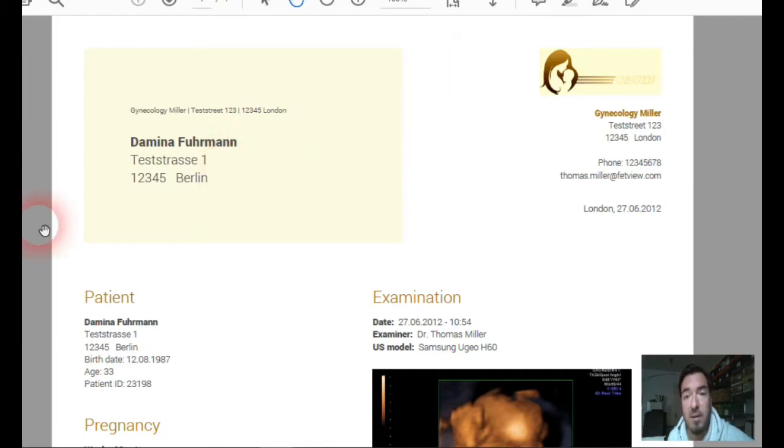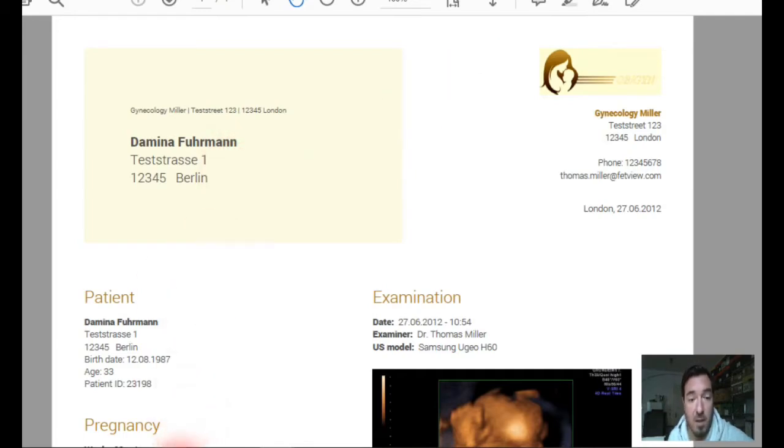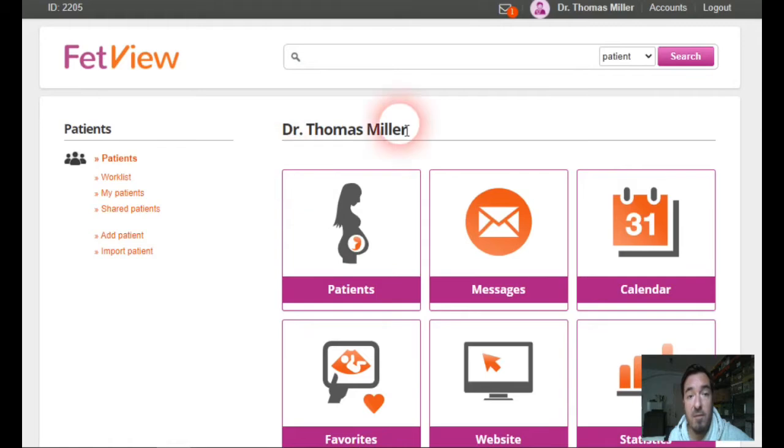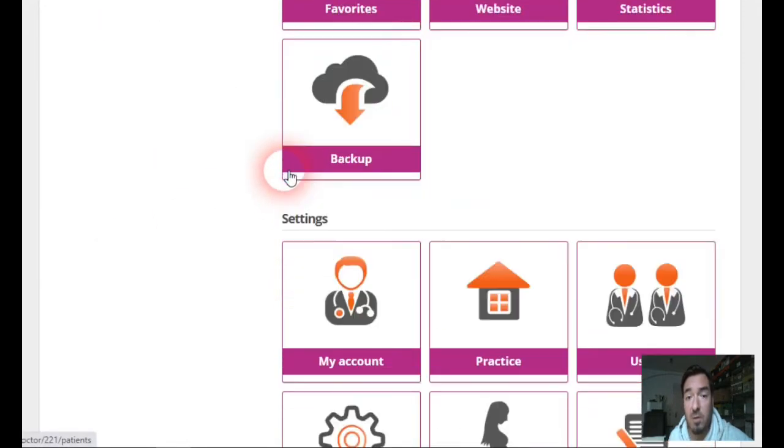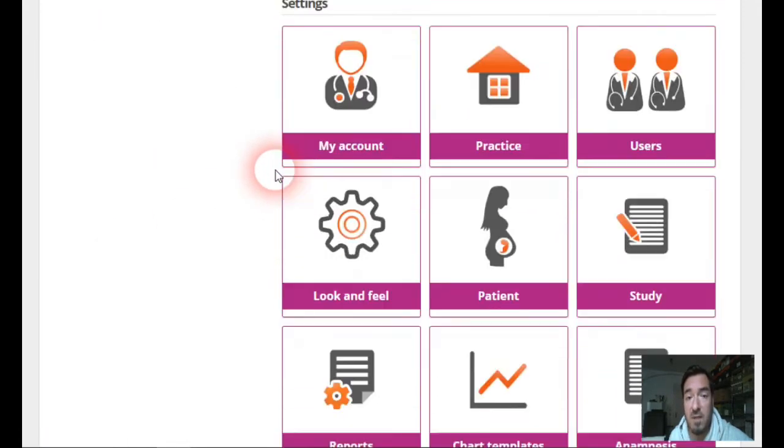But how can we change the appearance of them? If you go to your main page of your FatView account, you scroll down to settings and you will find the field look and feel.